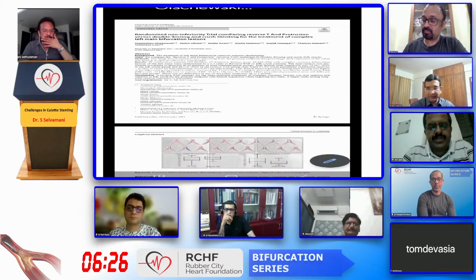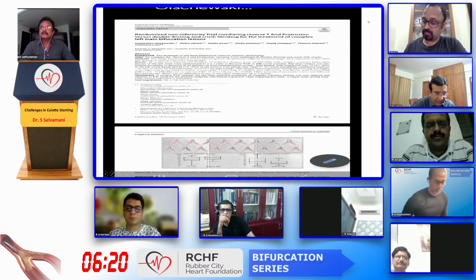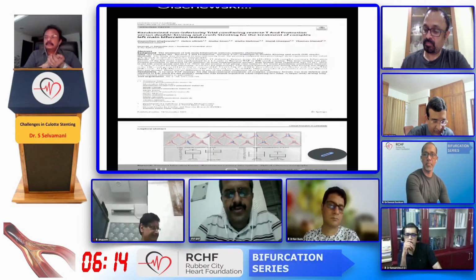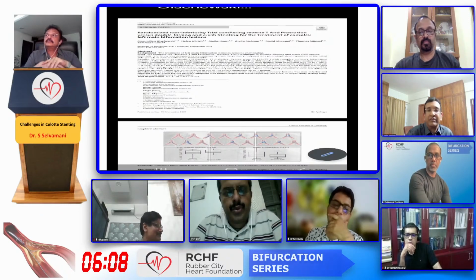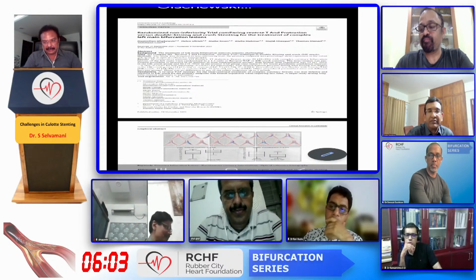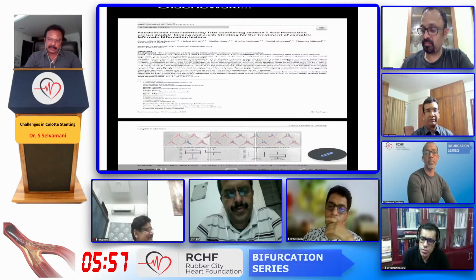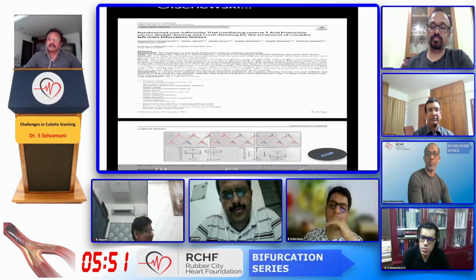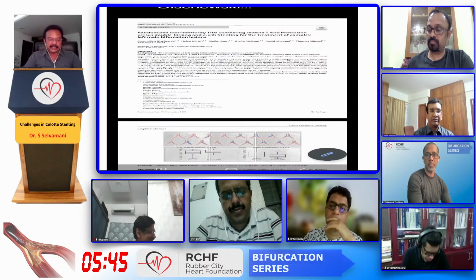But just to understand the first case, when you have the thing on the OCT, do you call it thrombus or tissue prolapse? Where is the structure prolapsing? The circ earlier was disease-free. So after the initial stent, you had something in the ostium of the circ. Would we call it thrombus? Just to understand, actually. No, that was actually when we dilated the LAD and stented the LAD at the distal left main. Probably there was a dissection and then there was something protruding, which we called tissue prolapse. And why we did it is because even after stenting, it was seen behind the stent, but the stent expansion and the area were very good there.